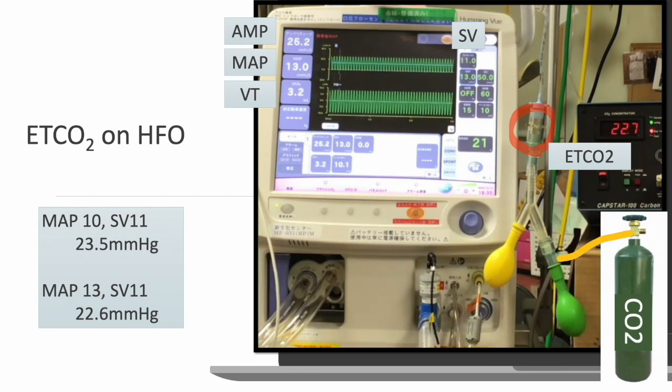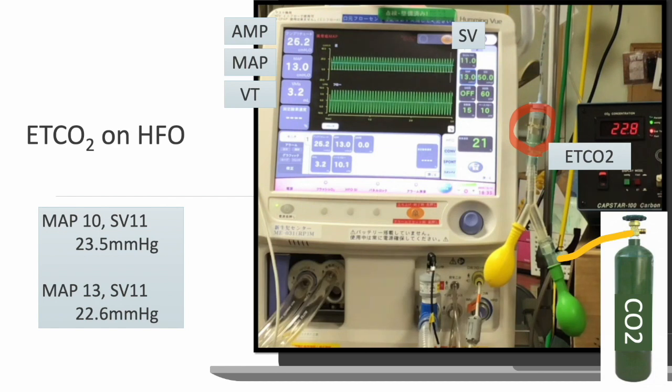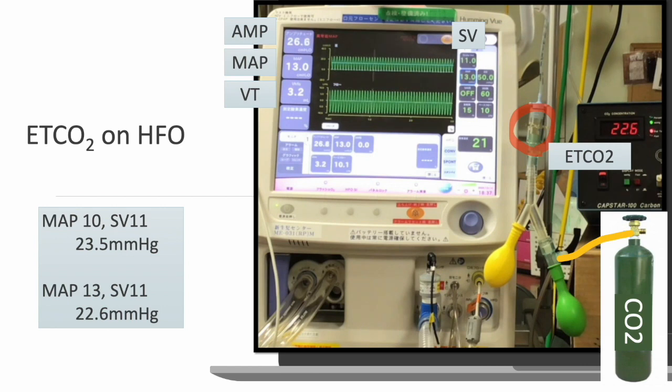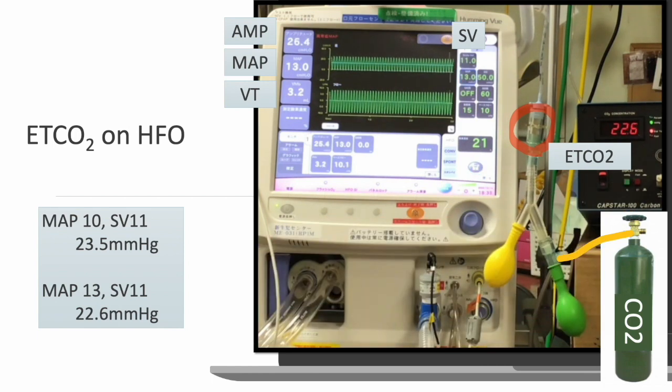was not changed. In actual patients, we expect to improve oxygenation by increasing MAP. And then, increasing MAP improves lung compliance. This result shows that setting MAP to an appropriate value improves oxygenation, but also improves ventilation because tidal volume improves as compliance improves. Even the slightest change in tidal volume will decrease CO2 concentration.